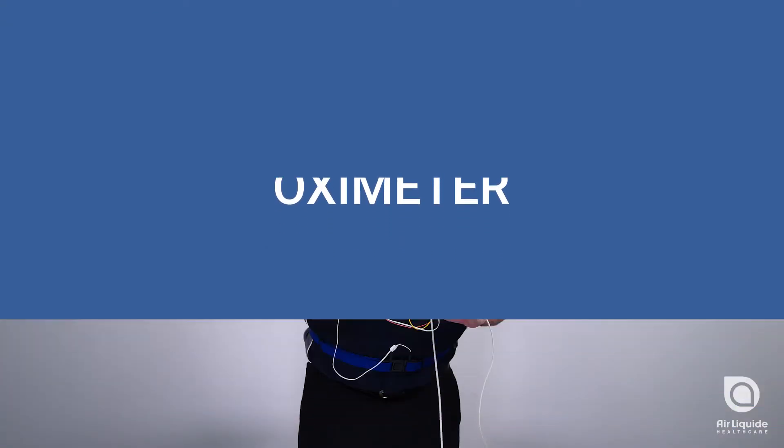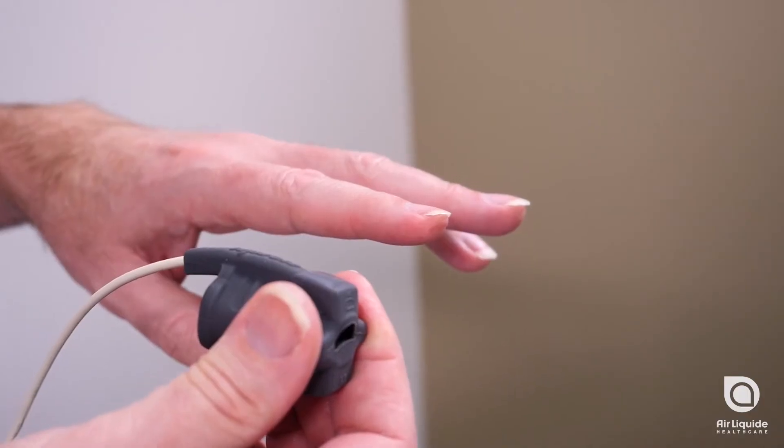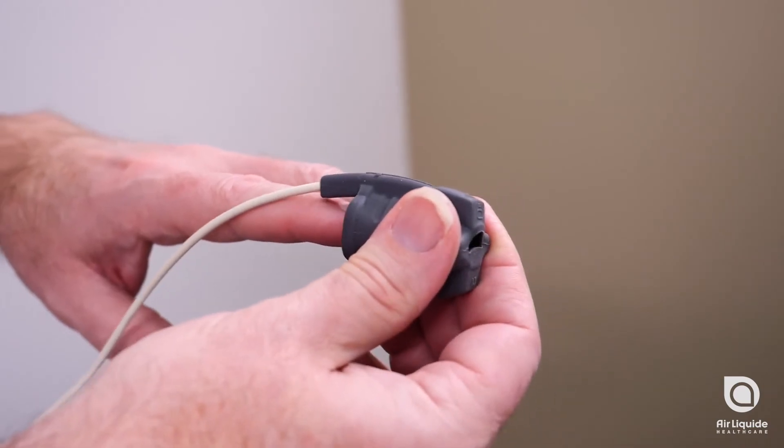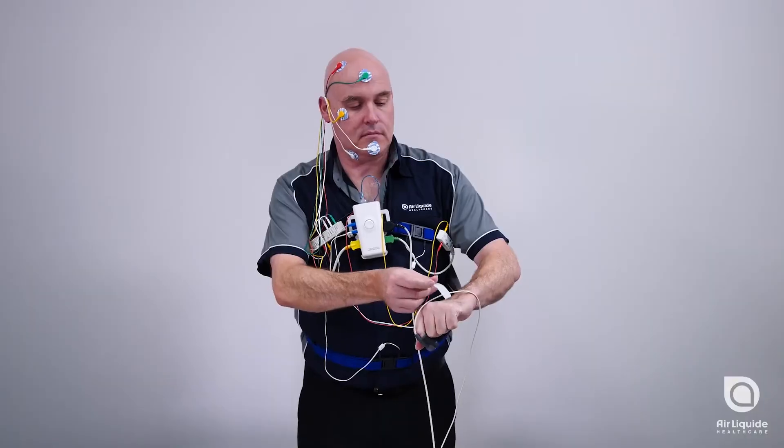The sensor should be attached to your index or middle finger on your non-dominant hand, with the cord running along the back of your hand. Your finger should go all the way to the end of the sensor, but not through it.